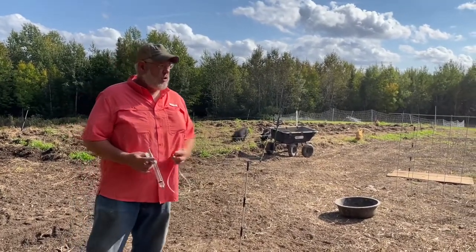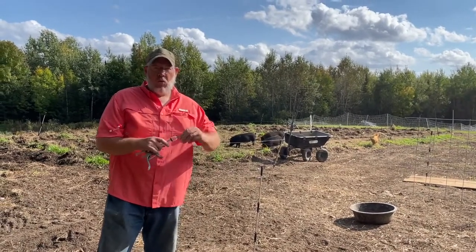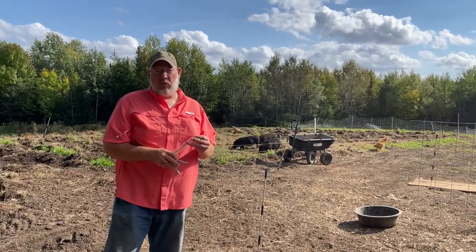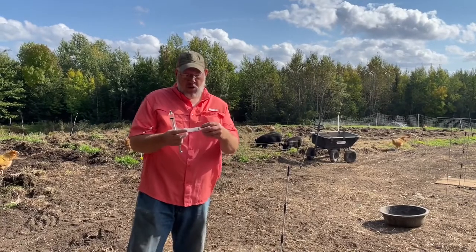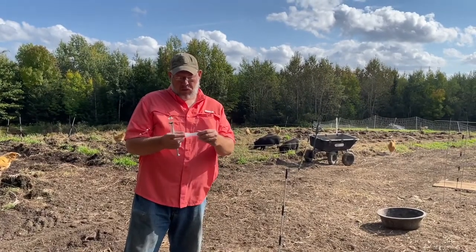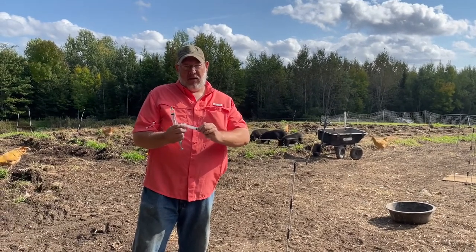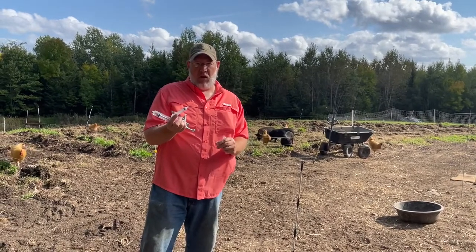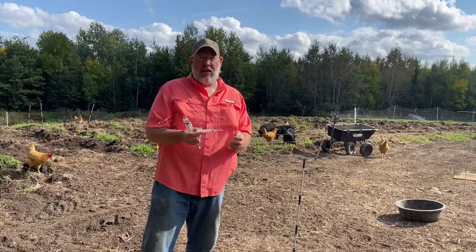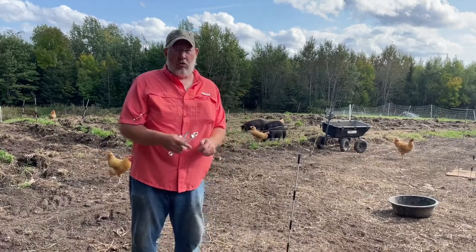So traditionally we would use a syringe like this with a removable needle — that needle we call a lure lock needle. Sometimes you can buy needles that already come with the lure lock needle attached. But a lot of times if we use a needle like that, we're going to wind up snapping it off because the pig's not going to enjoy getting that shot. They're going to try and run away and they're going to snap or bend the needle, and then you have real problems.